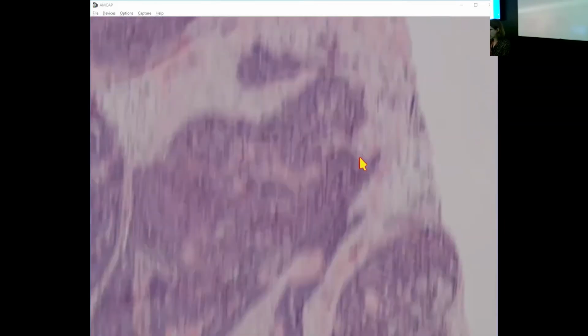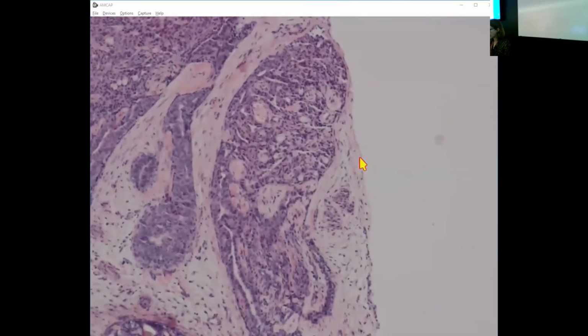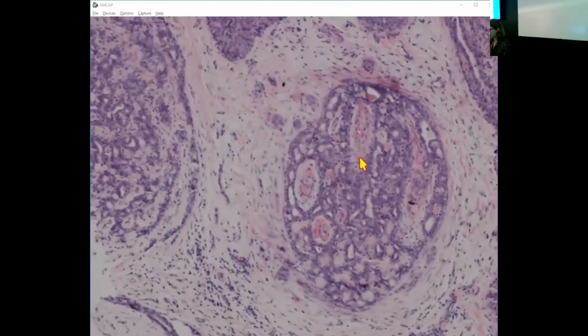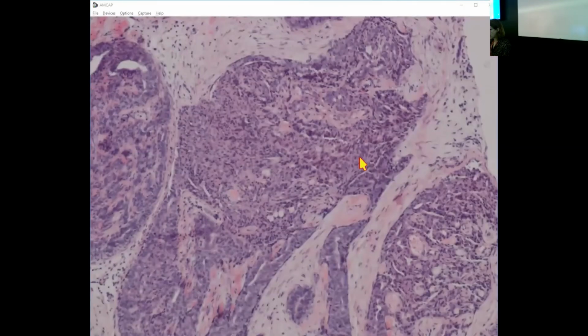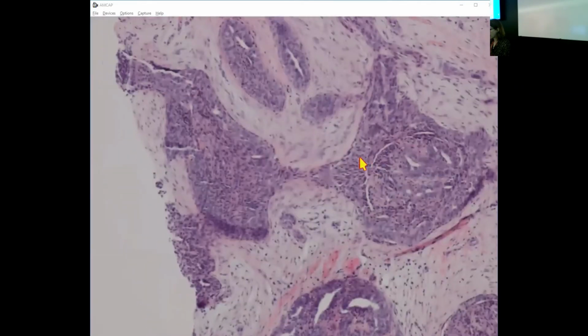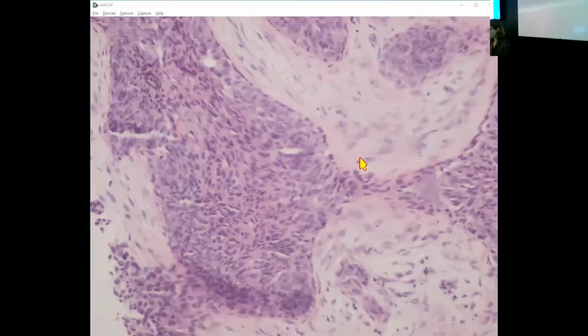And so I think having made the judgment that you've got something that's within a duct and something that seems to be papillary, and that there are myoepithelial cells on the fibrovascular cores, then you look at the epithelial proliferation and decide whether it's an atypical or non-atypical proliferation.